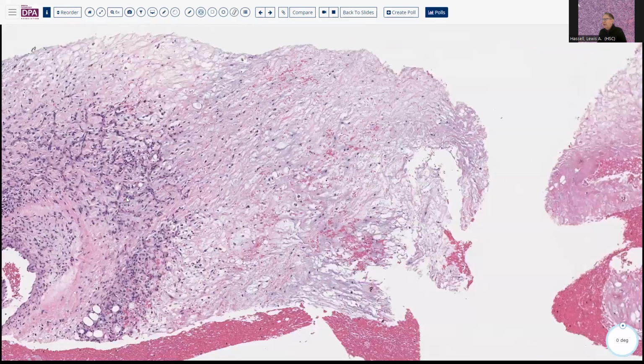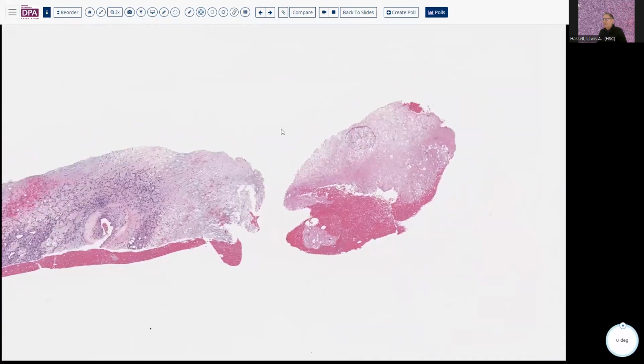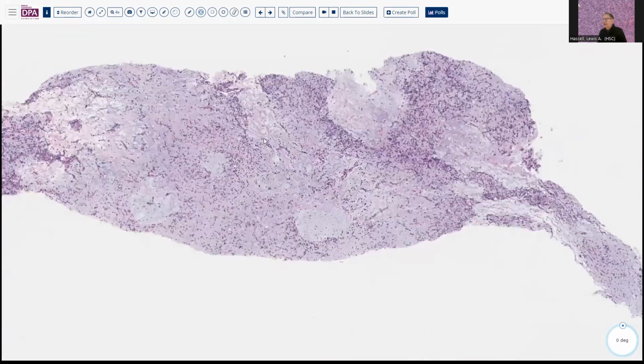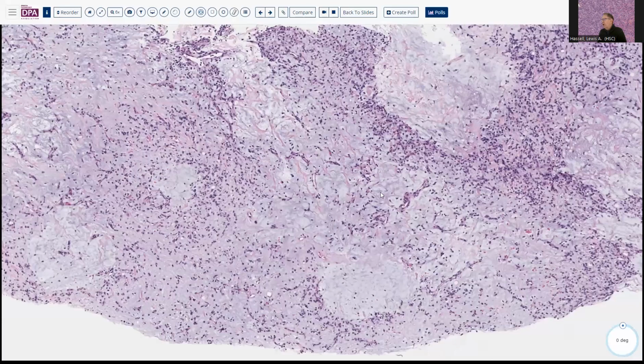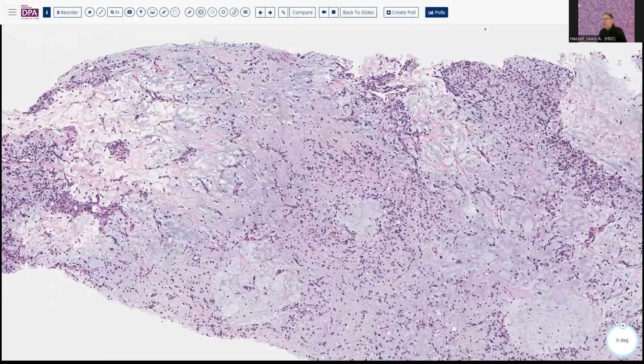So needle biopsies can be very challenging because you don't always see the full architecture. You see zonal architecture. Here's another area of this lesion showing you more clearly this branching, arcading pattern of vasculature in this very myxoid background. Because it's so myxoid and very vascular, if you had an area that's exclusively like this, you're not going to be thinking liposarcoma. Where's the lipo component to this?